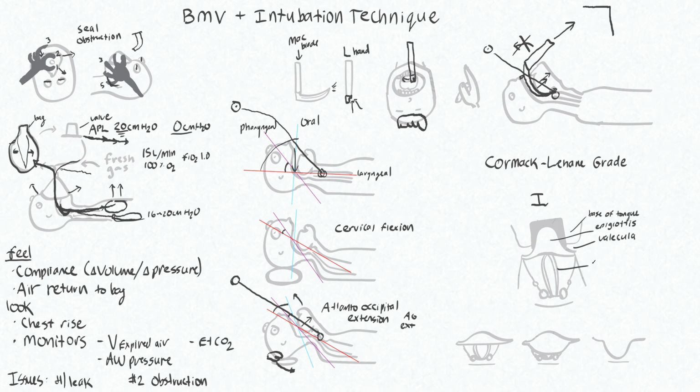So we've got the true chords here, and then between your chords, you'll be able to see into the trachea. So this is the anterior trachea that you're looking at, and those would be tracheal rings. You might be able to see those. This paired cartilage here is called the arytenoid cartilage. And there's another cartilage that sits right on top of that.